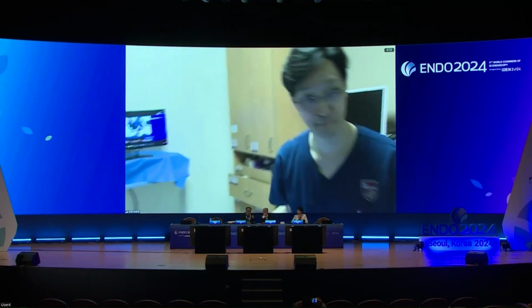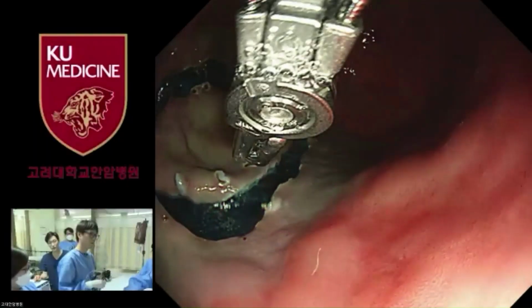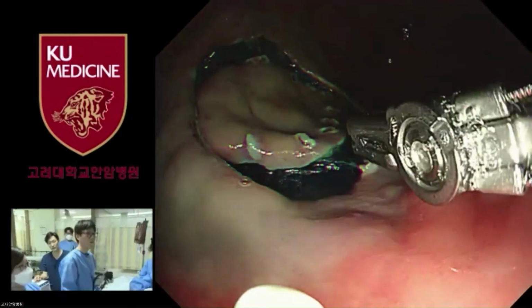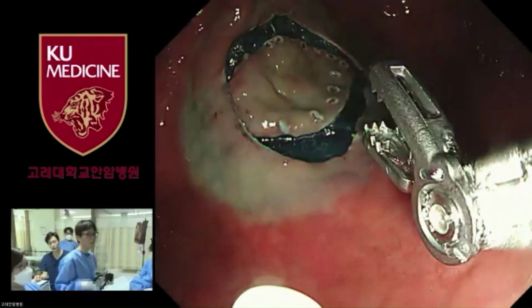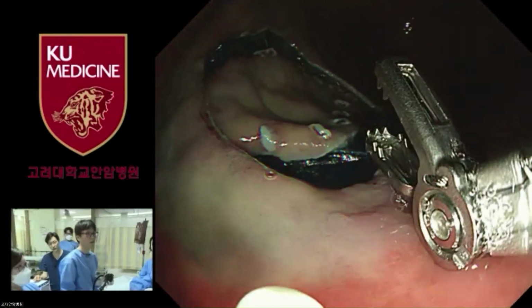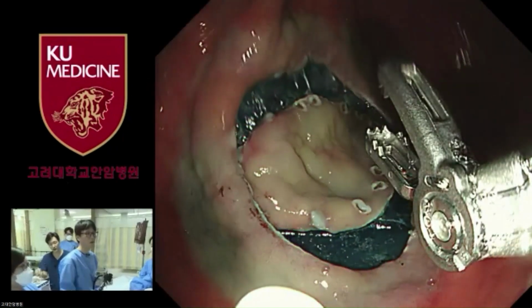Do you have this also for the colonoscope, or only for the gastroscope? This can be used for upper and also for lower. This afternoon we are going to show the colon case. But unfortunately we cannot use the robotic device for the colon this afternoon.